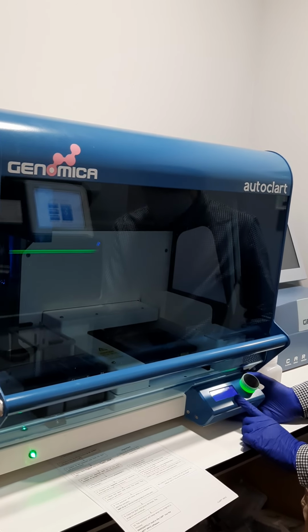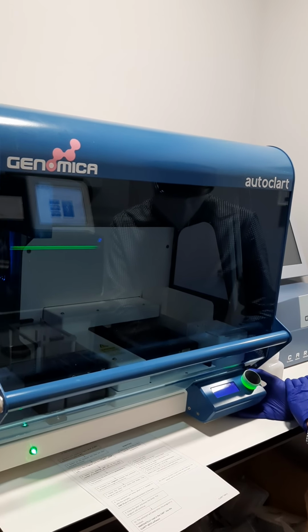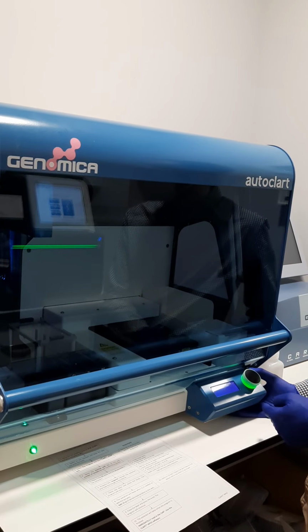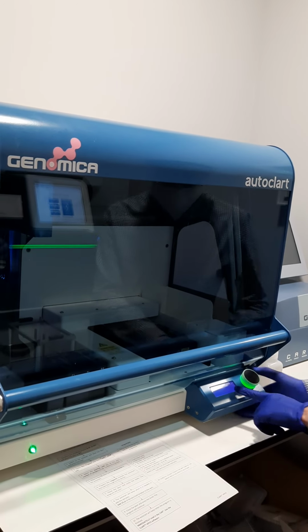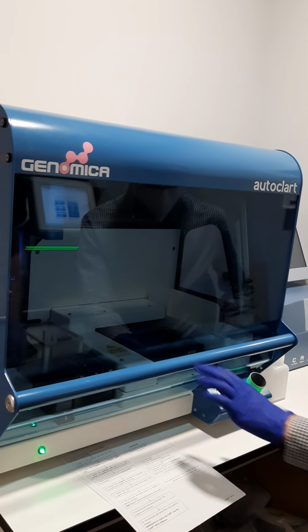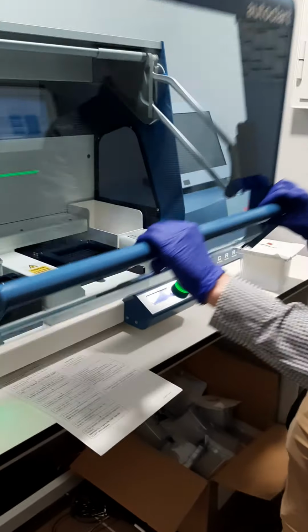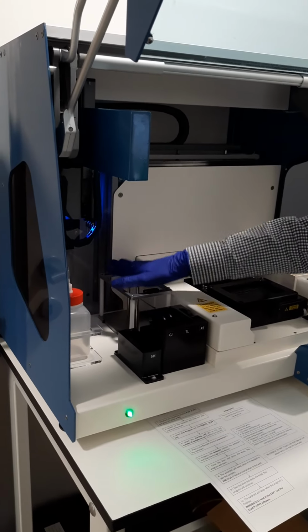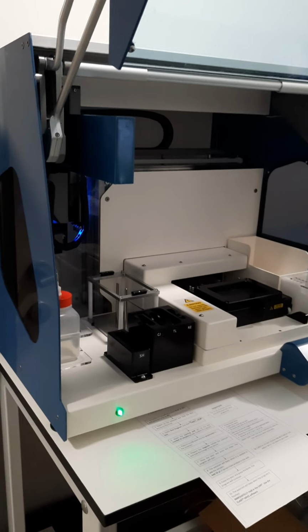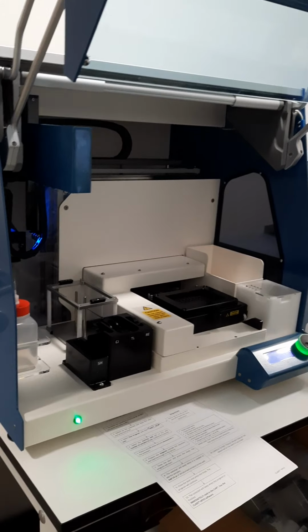Okay, it's going to confirm that we want a sample from A1. Yes. We press to confirm. And then it's going to indicate what we have to do. Load tip rack, that is this one. Okay, these tip racks are going to be placed here. There is only one position for the tip racks. Okay. I'm going to do one with you later, so we can do it in this way.